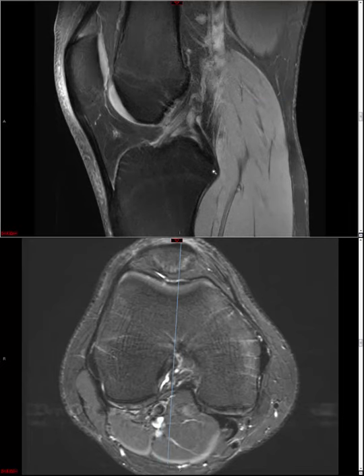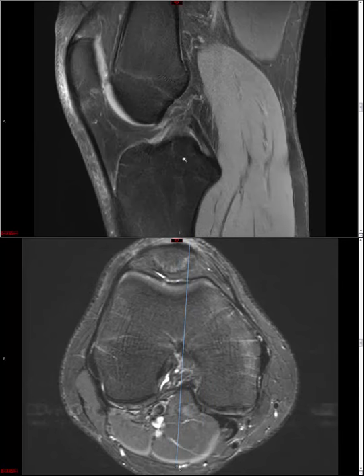Some ACLs you're going to see look intact but they're expanded and have diffuse increased signal, like a turkey drumstick. Not shown here, of course, in this normal example. That has been likened to mucoid degeneration or intrasubstance ganglion formation, and I take that to mean that there's been some previous partial injury to the ACL, but clearly no full thickness disruption, so that should be reported.